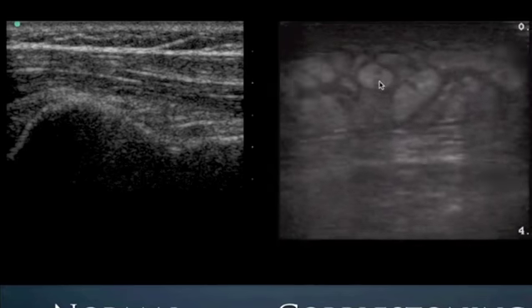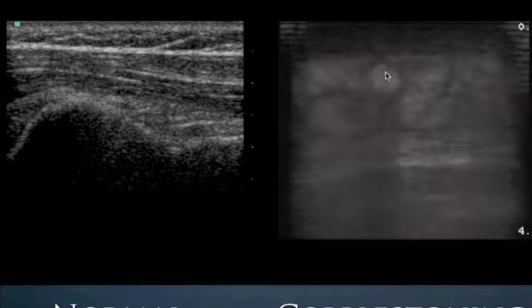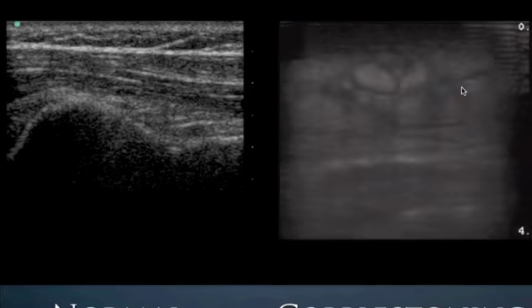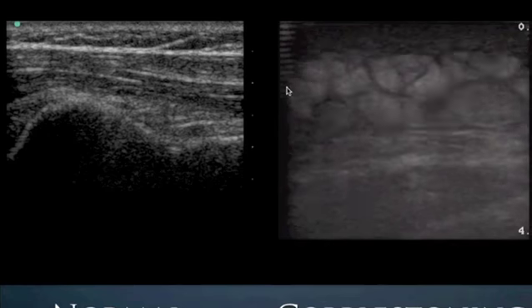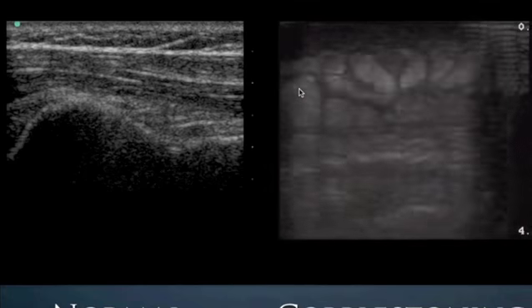Notice the hyperechoic areas of inflamed soft tissue seen here with hypo or even anechoic areas between them. These islands of hyperechoic areas are referred to as cobblestoning of cellulitis. Sometimes this is also seen in patients who simply have edema, but there's no abscess demonstrated here.